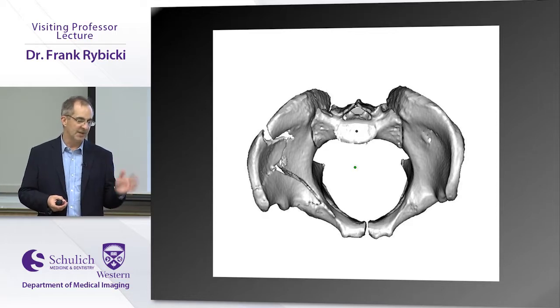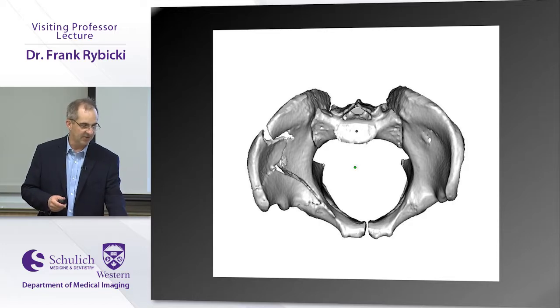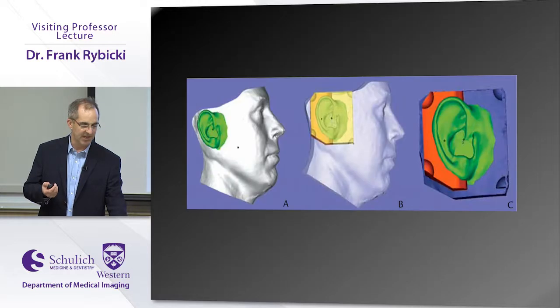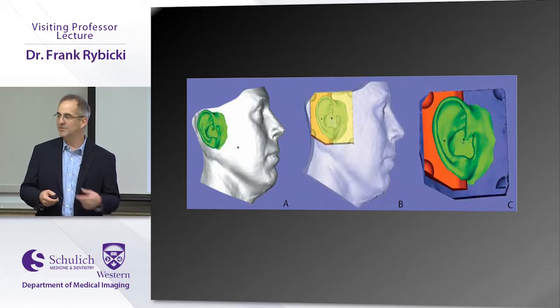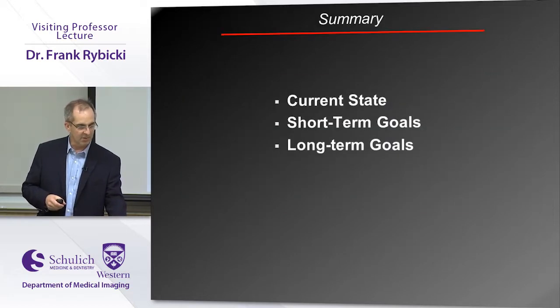The concept of doing this and putting these cheap models in underprivileged countries and actually being able to give medical care where you completely couldn't give it is completely revolutionizing. There's a lot of crowdsourcing, a lot of funding going into doing that, and it's amazing who just doesn't have a splint that will fit their broken hand. It's mind-bogglingly shocking. People in the Wounded Warriors Project, people don't have ears, people don't have parts, and so you can just custom make them all. And again, using the rotational photography to look at the other side and just make the model. So I'll wind it up.